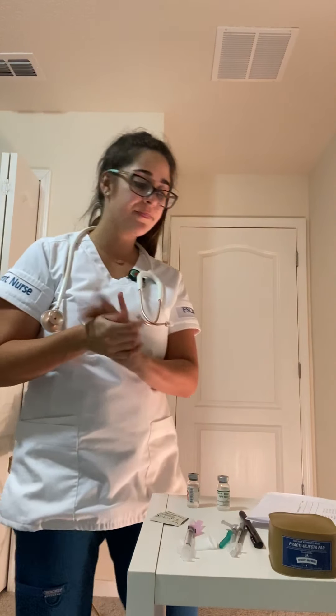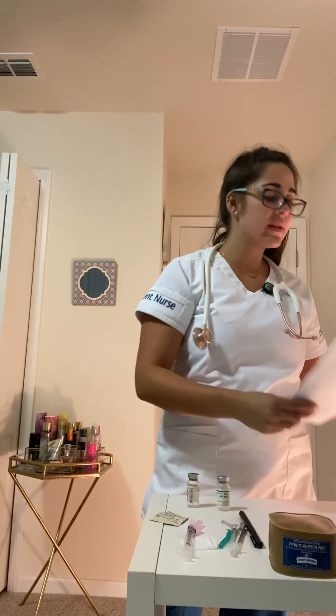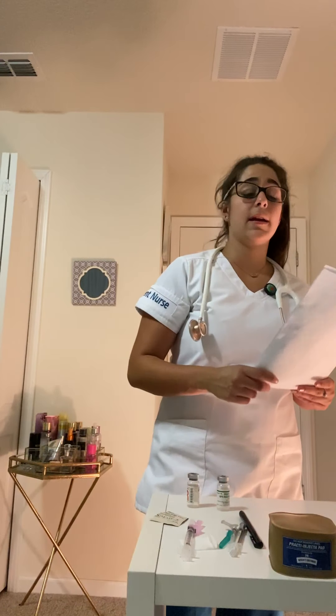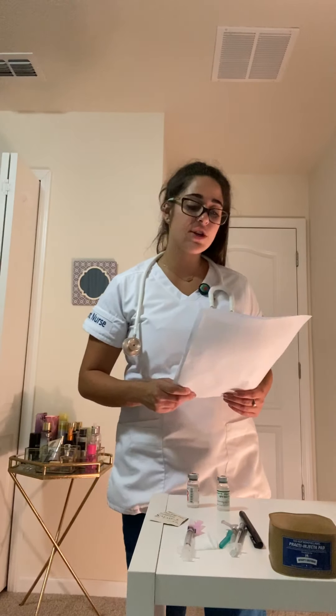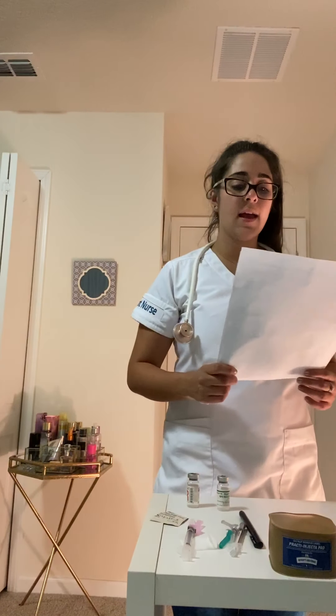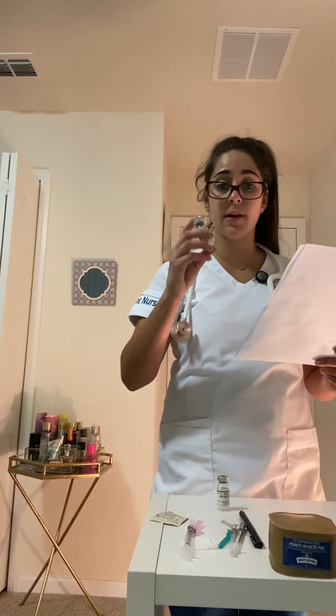I'm going to wash my hands. To begin, I'm going to take my medical administration record and my physician's order to verify the right medication is going to be administered. I have Kelly Jackson, April 20th, 9 a.m. She is receiving a subcutaneous shot of heparin for 3,000 units, and I have that right here.